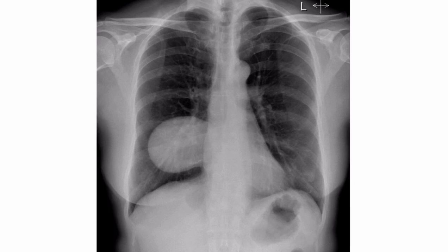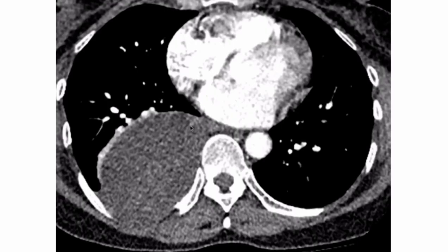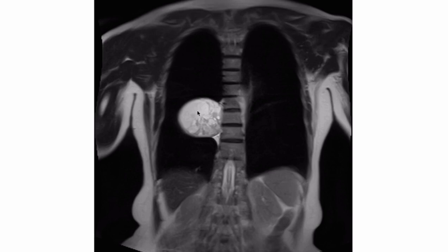On this chest X-ray we can see the outlines of the hilar vessels through the mass. We can also see the right heart border, which indicates that the mass is in the posterior mediastinum. This is confirmed on the lateral view and on CT. The MRI scan reveals the mass is a schwannoma.